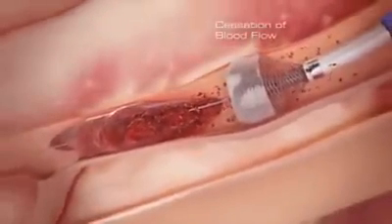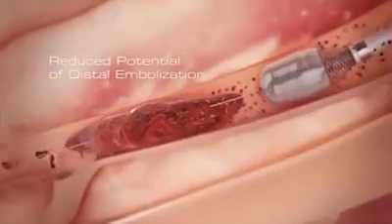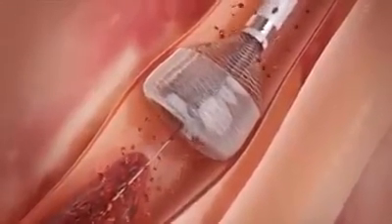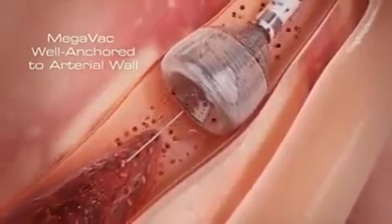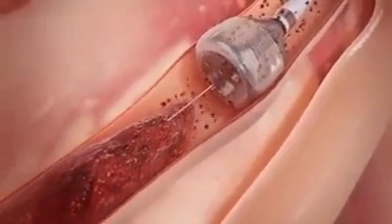Cessation of blood flow prevents clot fragments from traveling downstream, greatly reducing the potential for distal embolization. The patient's blood pressure, along with the radial force of the funnel tip, combine to press the device against the arterial wall, anchoring the catheter firmly and safely. The outward expansion of the Megavac anchors and centers the device, and can be used as an anchor for other devices in crossing tight lesions or tortuous vessels.